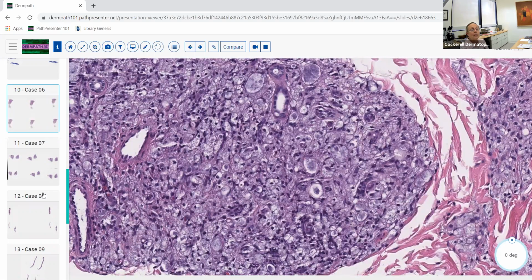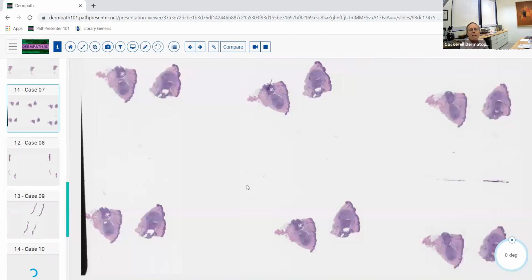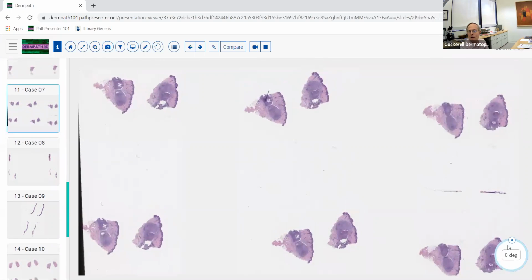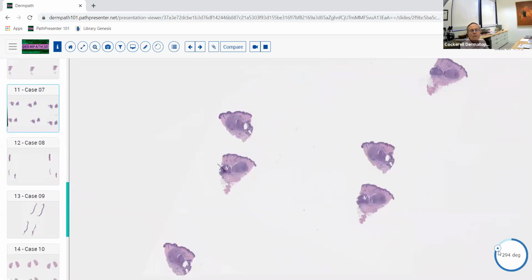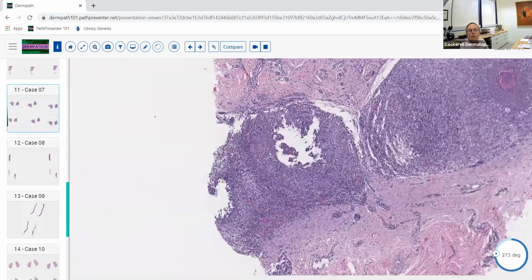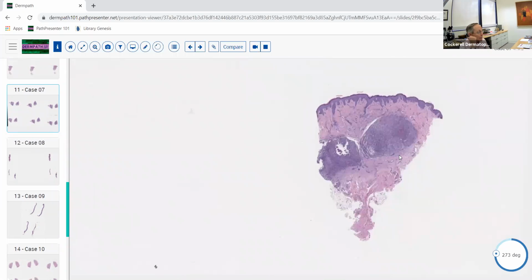And we happen to have a Fite stain in the next slide here. I think it's this one. No, I guess maybe you don't have a, yeah, we don't, I thought we had a Fite stain, but we don't. So anyway, this is polar lepromatous Hansen's disease. And this one too. A higher magnification, this one here. Yeah, this one's different. Okay, so we don't have a Fite stain of that. But anyway, that would have been loaded with organisms. We wouldn't have any trouble finding it at all in that polar lepromatous Hansen's.